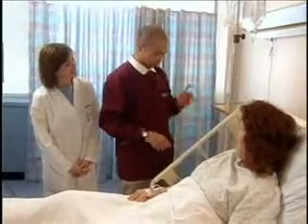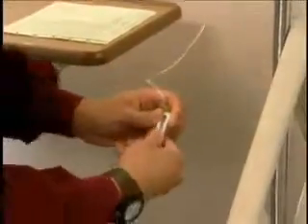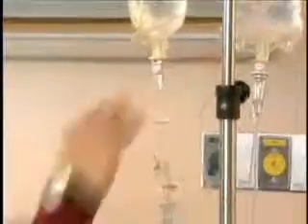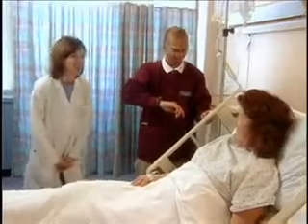Now that the infusion is finished, I close the roller clamp. I remove the volume control device. Very good. And I recap it. Then I recheck the flow rate of the primary infusion. Very good. Thank you. All right, Mrs. Parker, is there anything else we can do for you?